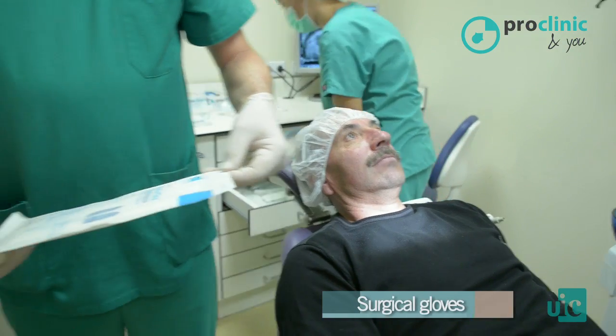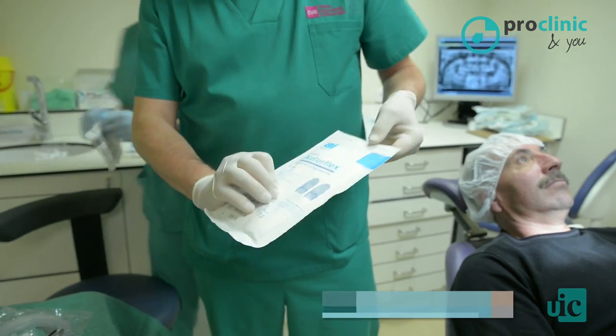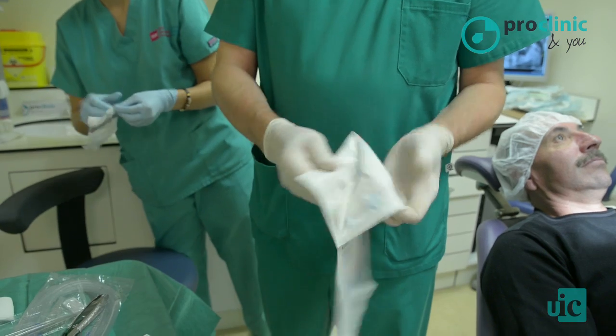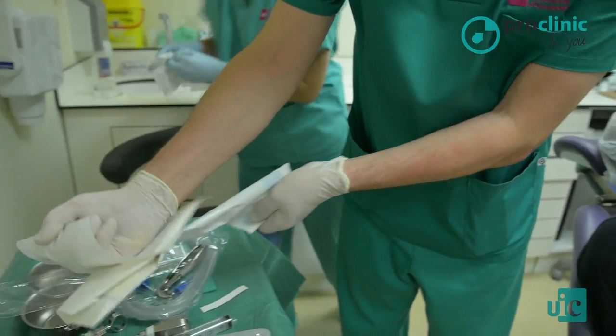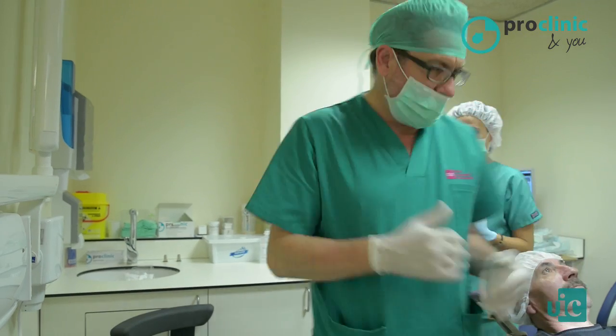These surgical gloves also come sterilized from factory. I have cleaned my hands properly with a specific soap, but I cannot touch them yet. Once we have all the instruments on the surgical table, we are going to prepare the patient.